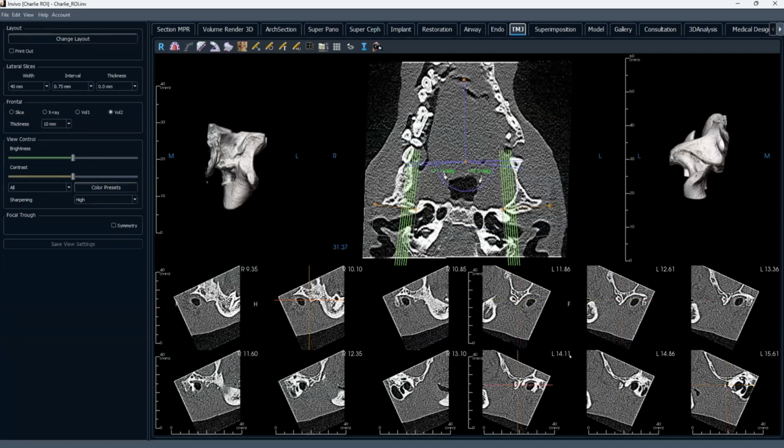We've taken just a smaller part of the scan, basically just the jaws and the TMJs, and re-rendered it. The VetCat puts out a whole new stack of 500 some slices of just the small area I selected, at 0.07 millimeters, about a quarter of the thickness of what we started with.